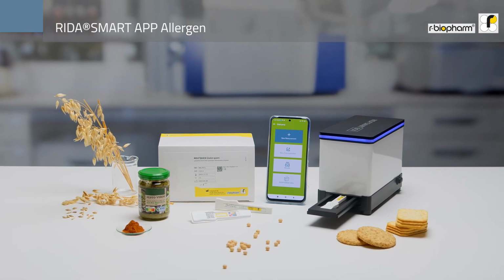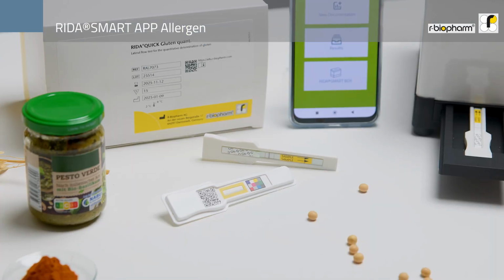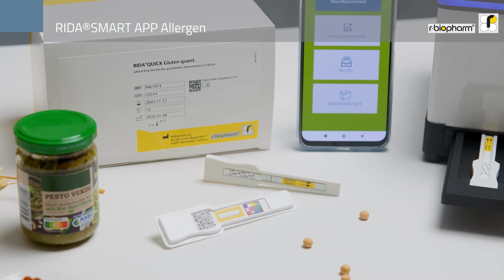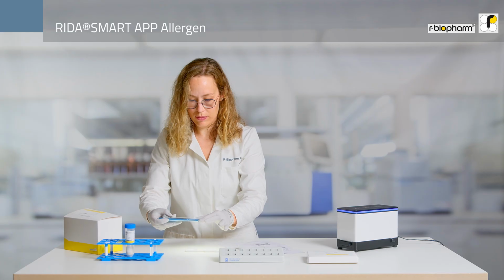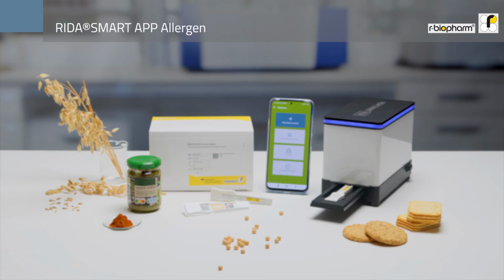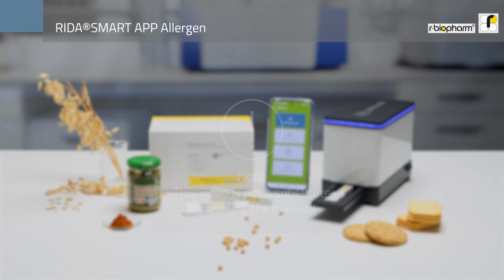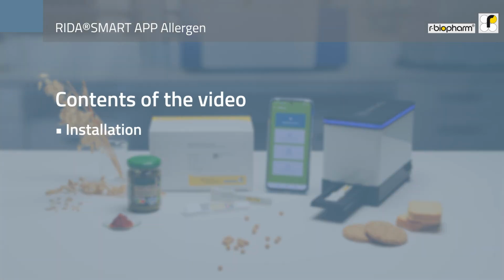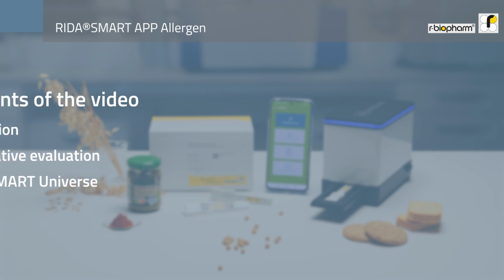In this video, you will be guided through the whole evaluation procedure of quantitative allergen test strips using the RIDA SMART App Allergen. The RIDA SMART App Allergen is the new innovative software solution for the quantitative analysis of our allergen lateral flow tests and paves the way for a new digital era. In this video, we show the installation process, the quantitative evaluation of test strips, and the app's connectivity via the RIDA SMART Universe.